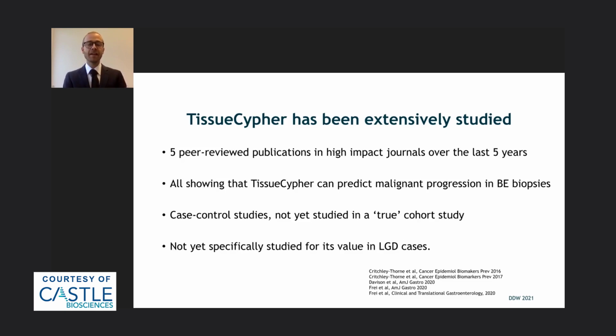However, these were mainly case control studies, and with the exception of the last publication, TissueCypher was not yet studied in a true cohort study. Additionally, TissueCypher was not yet specifically studied for its value in LGD cases, but mainly in non-dysplastic cases.